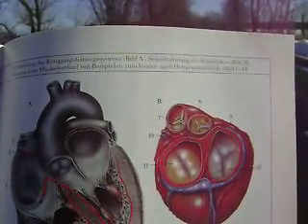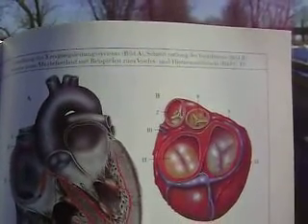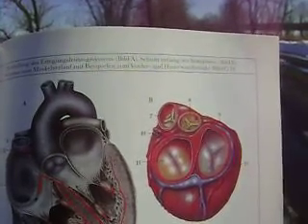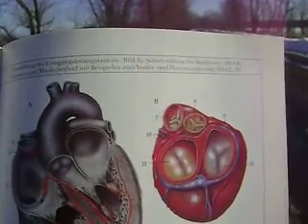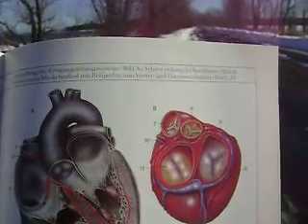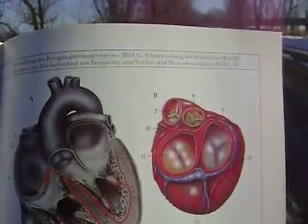This contrast dye permits the cardiologist to see the entire vasculature of the heart, and this way they're able to see if there are blockages in any of the arteries.